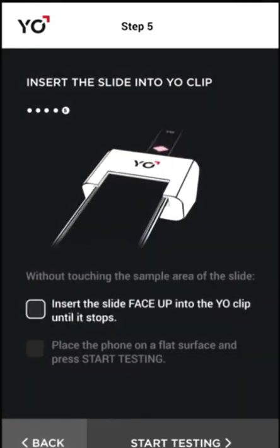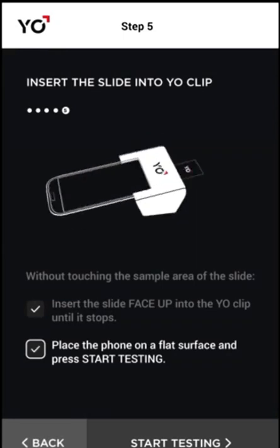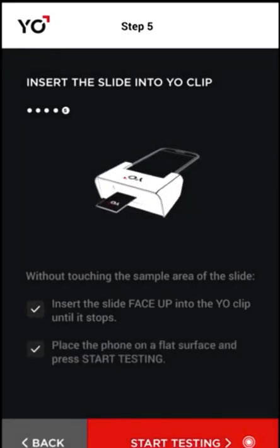Insert the prepared slide face up into the YO clip. Tap start testing.